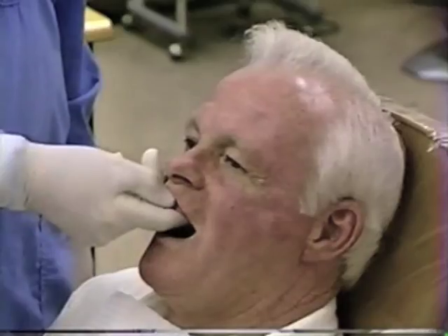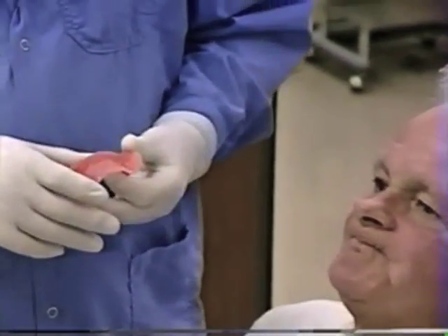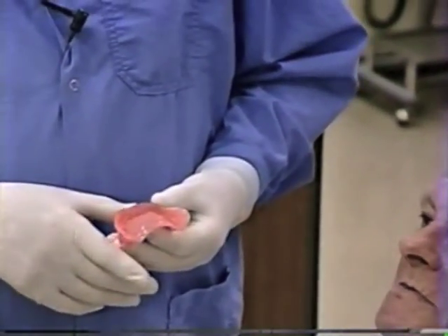There are two phases to establishing the posterior palatal seal. Number one is you need to establish how long you want the maxillary denture to be — how far back onto the palate it should go. The object is to try to get that seal, or the length of the maxillary denture, to occur at the junction of movable and immovable tissues.